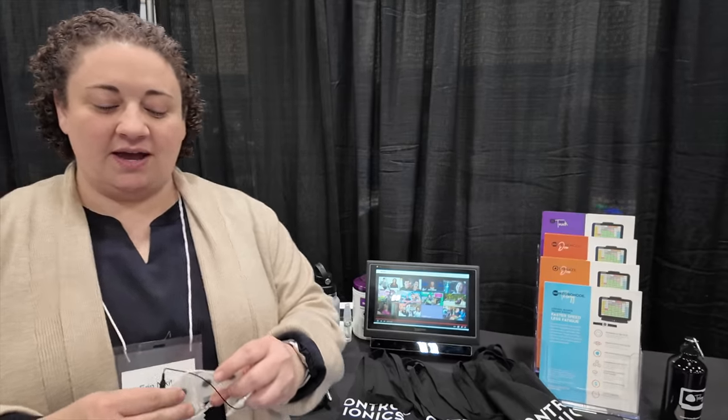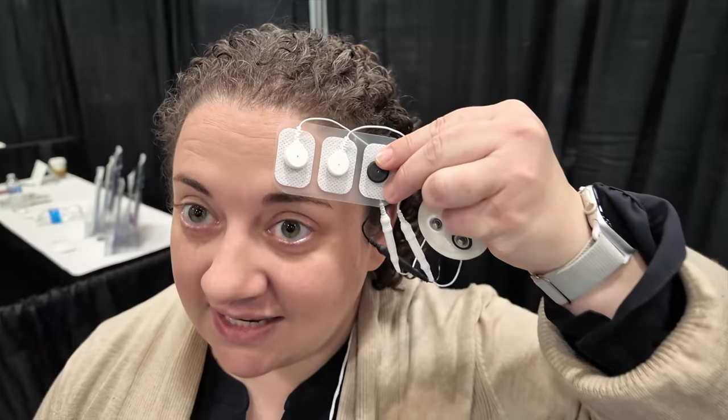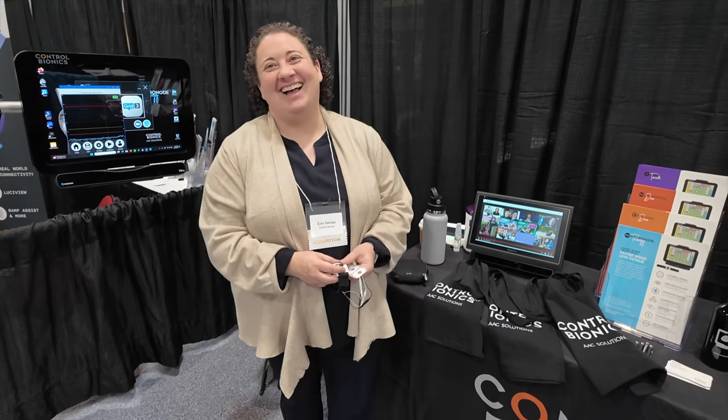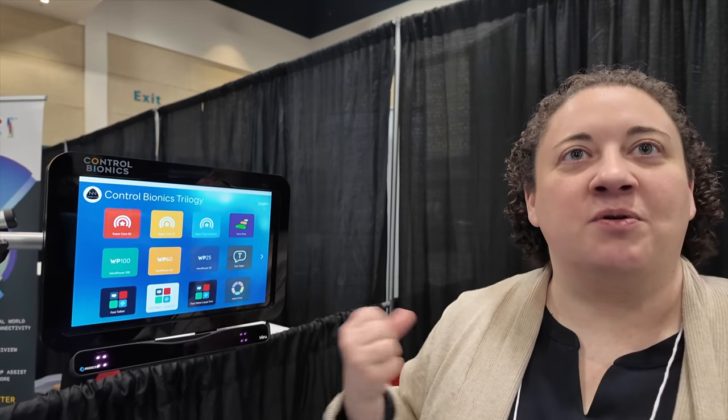Even too, if somebody only can move their eyebrows, we have sensors that can go straight above their eyebrow and they raise it, and then that's what tells the computer to work. Wow. So get in touch. All right. Well, I certainly appreciate that. Thanks. But it has to be what the person wants to communicate.